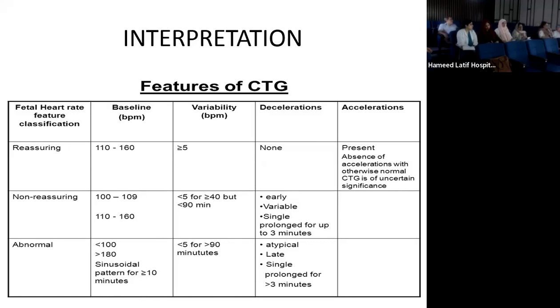Is there any test which we can do for fetal anemia besides the wave that we see? Forget the CTG for a second. Any other non-invasive test where you can see the signs of fetal anemia, which is the single most probable? What do you check on ultrasound for fetal anemia?